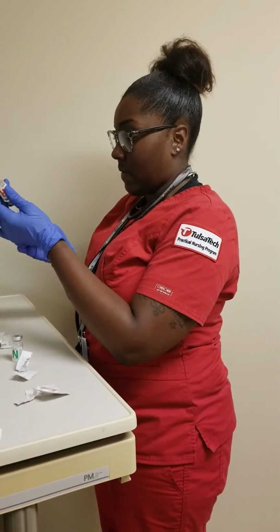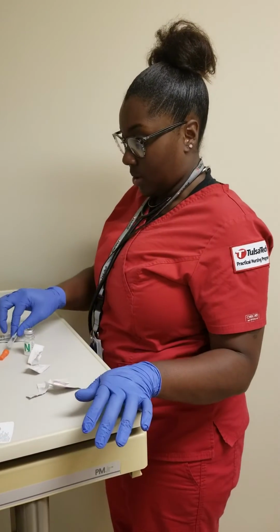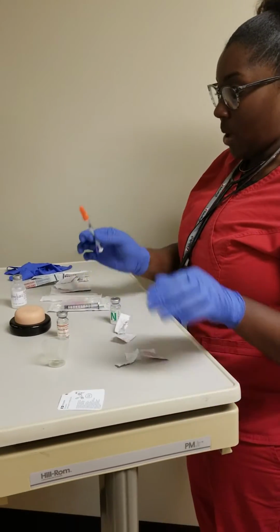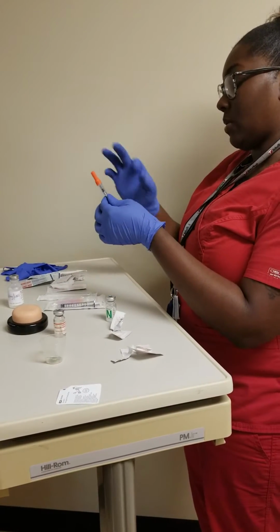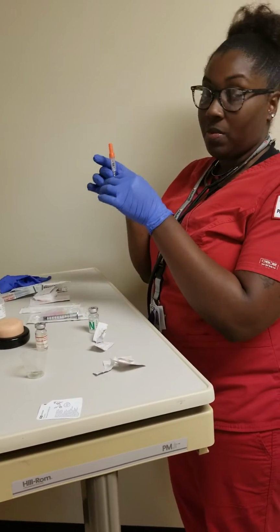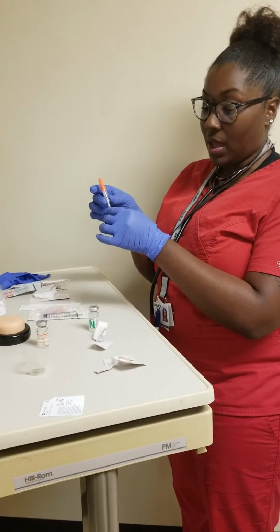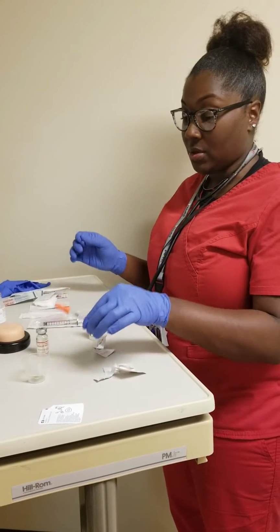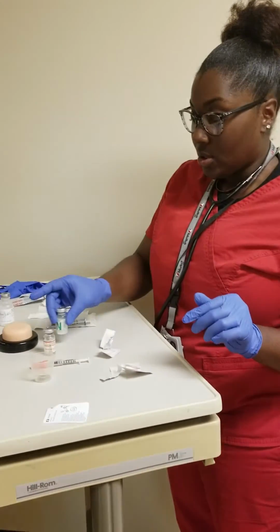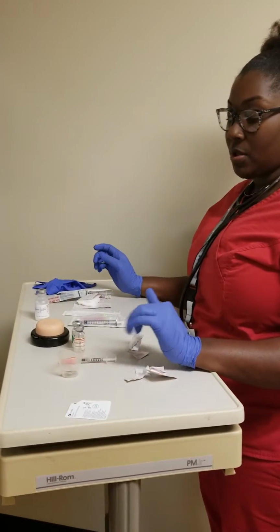So I took the 5 out. I will have a nurse verify that it is indeed 10 units altogether, and then I will label this with the patient's information to make sure that nothing gets lost or misplaced or given to the wrong patient or anything like that. So that will be my sub-Q injection.